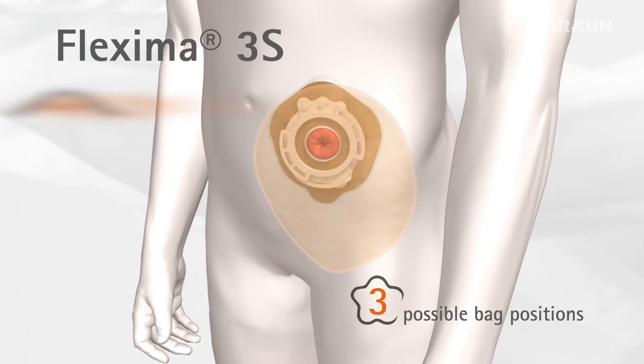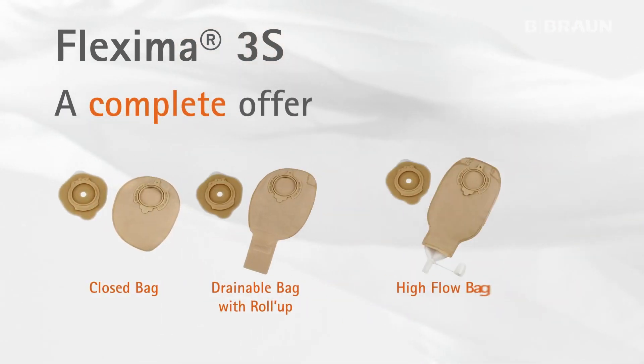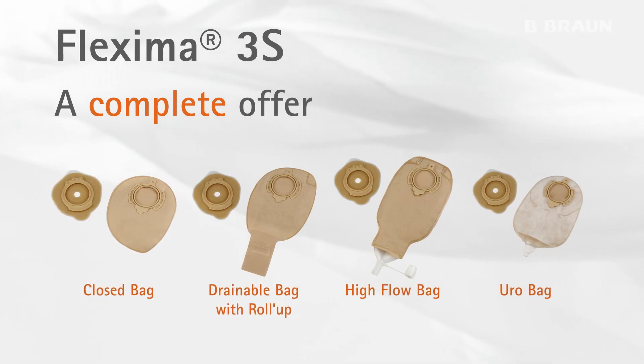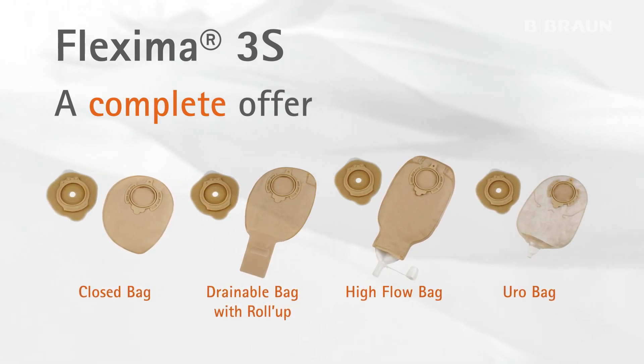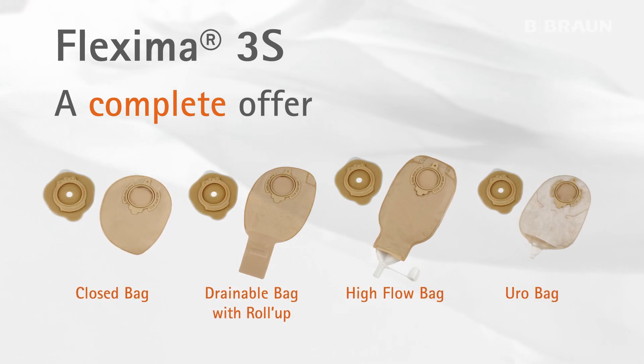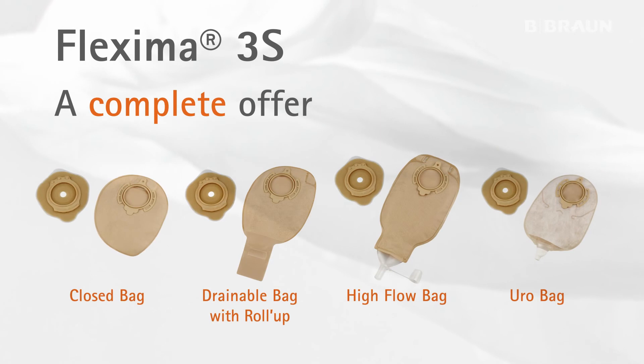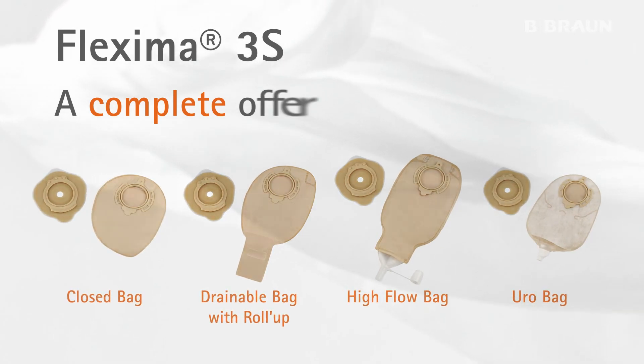The Flexima 3S system is available in closed, drainable, high flow and uro bags. Beige and transparent, each type to cover all patients' profiles. Base plates are either flat or convex, according to the peristomal configuration.